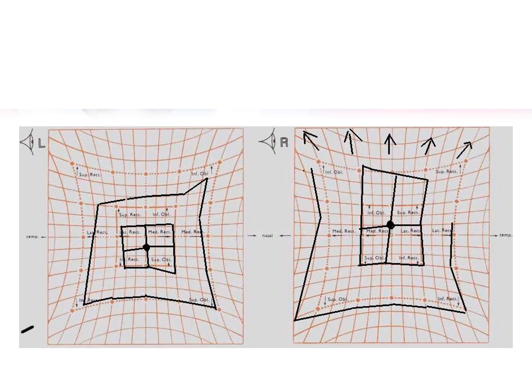In this example, the left eye is the eye with the primary pathology, as it has a smaller field. There is limitation of elevation of the left eye in abduction, consistent with a superior rectus deficit. The cause of this limitation is restrictive for two reasons.